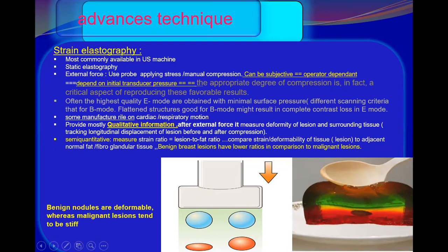it will be operator dependent. Because you might give more pressure or less pressure, and it should be an appropriate degree of compression. Otherwise, it will not give a favorable result. Some mention that it has to be minimal surface pressure. Others say that if it is also very minimal, it might not give an optimum result. So it has to be optimized, and this is subjective.